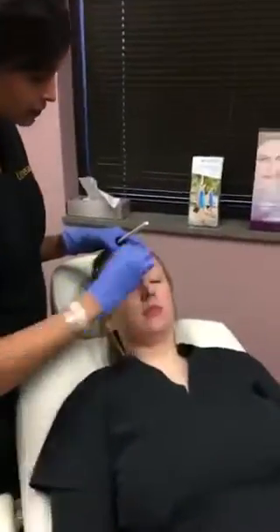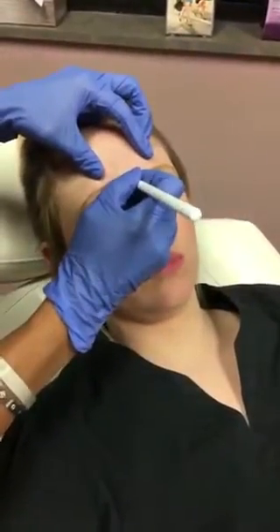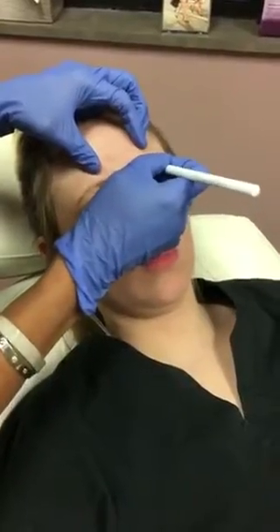Lexi has had Dysport in the past — it's been about six months since her last treatment, so we might see a bit of residual effect still. Go ahead and squeeze your frown brow for me. You can see that she has some movement but it's definitely muted compared to previous. That's one good thing we notice about patients who regularly get Botox or Dysport — their muscle starts to atrophy or weaken, and over time they sometimes don't need it quite as frequently. So we'll mark out where her muscle belly is strong.